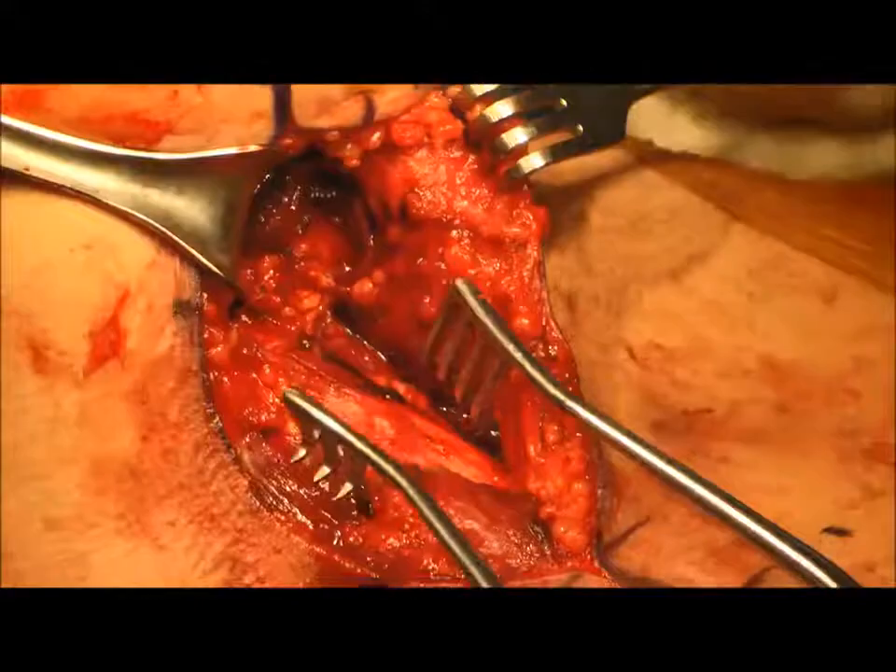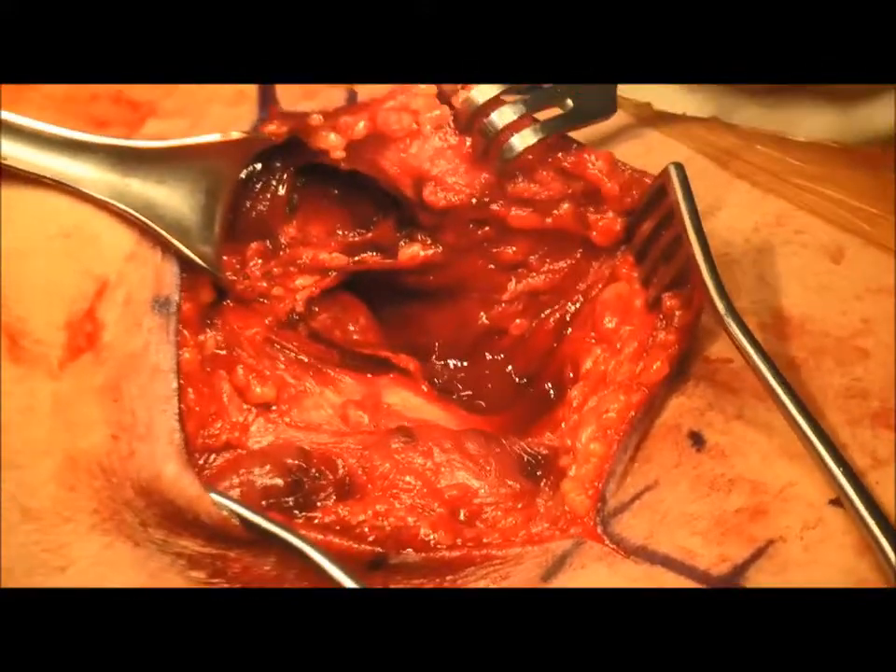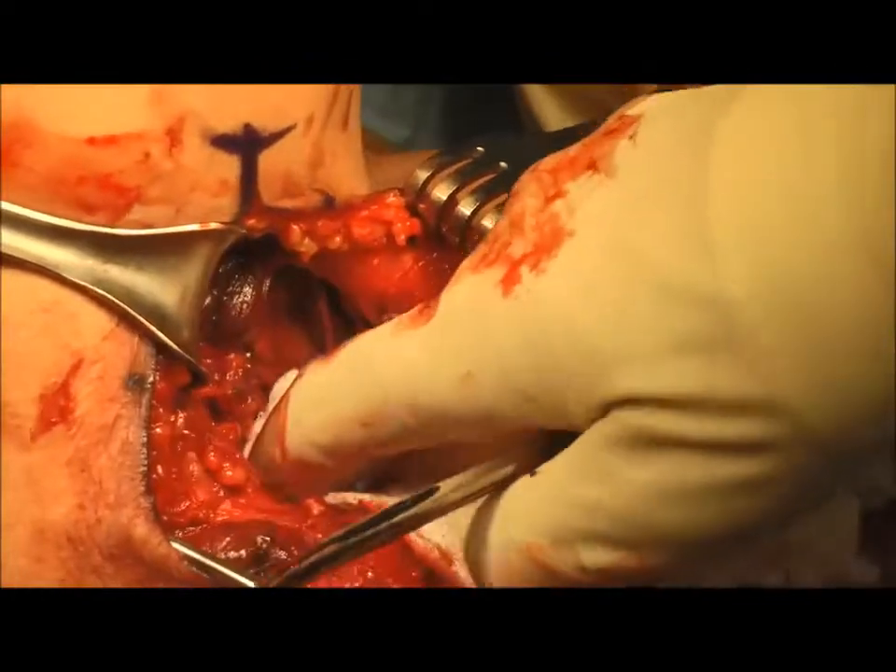With a mixture of sharp and blunt dissection between the triceps and the pec major, the ruptured latissimus tendon is identified.